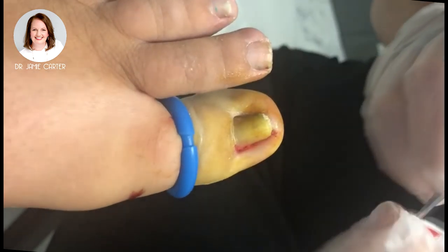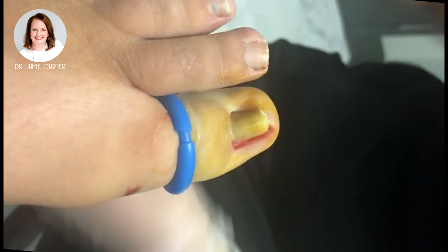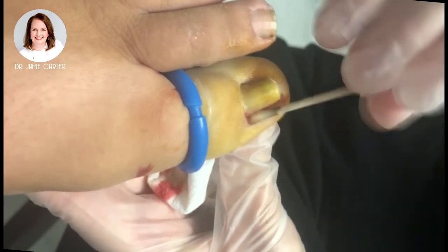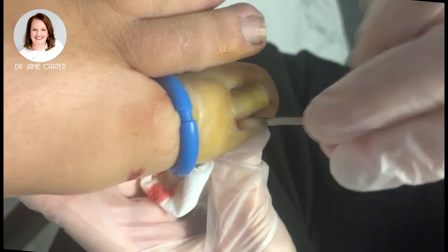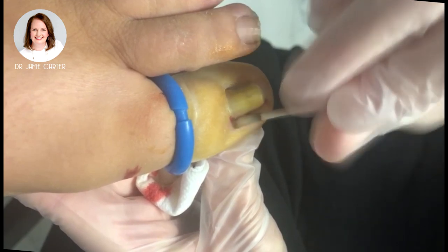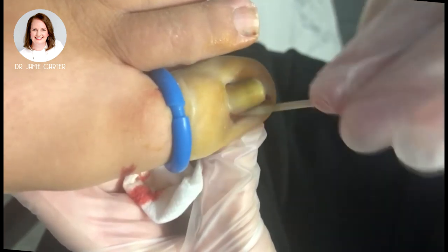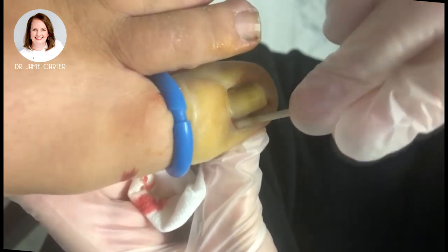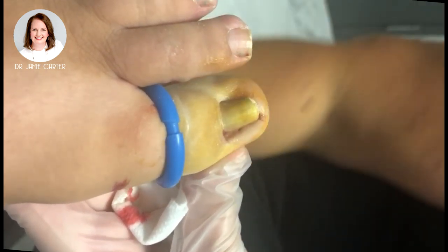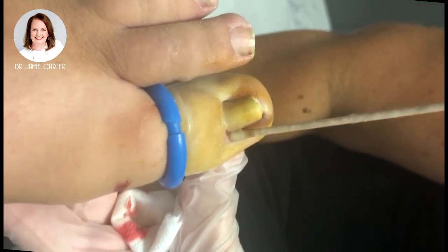Very minimal bleeding compared to what you would probably expect for a procedure like this. This is our chemical — here at the office we use sodium hydroxide. Compared to other chemicals used, it actually doesn't give as much redness, swelling, irritation, or pain. It will kind of turn the tissue black when it mixes with blood. Three little applications is all it takes, and then we neutralize it with a vinegar solution.